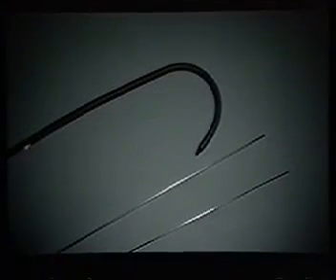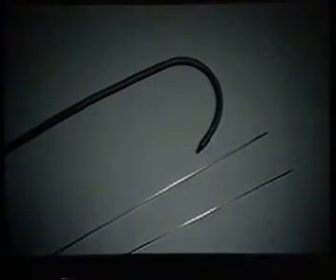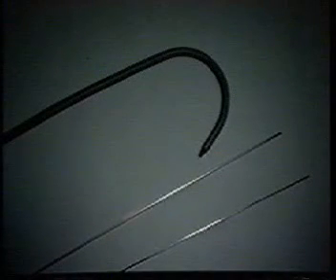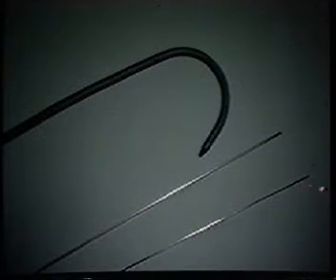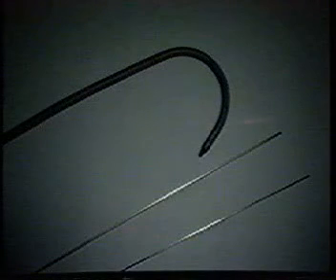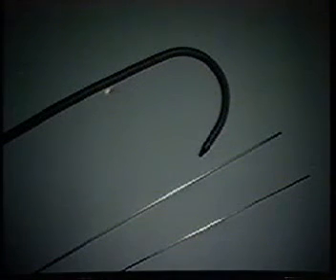Here's an example of a Mueller catheter, which is a catheter which comes anywhere from 10 to 16 French in diameter. You can see here this is the stiffening cannula, and this is the sharp-tipped stylet, and this is a catheter that is meant to be placed using a trocar technique. Once the catheter is in the fluid collection or in the abscess, it retains this curved shape, and there are fairly large multiple side holes in the tip of this catheter in order to drain fairly thick fluid collections.